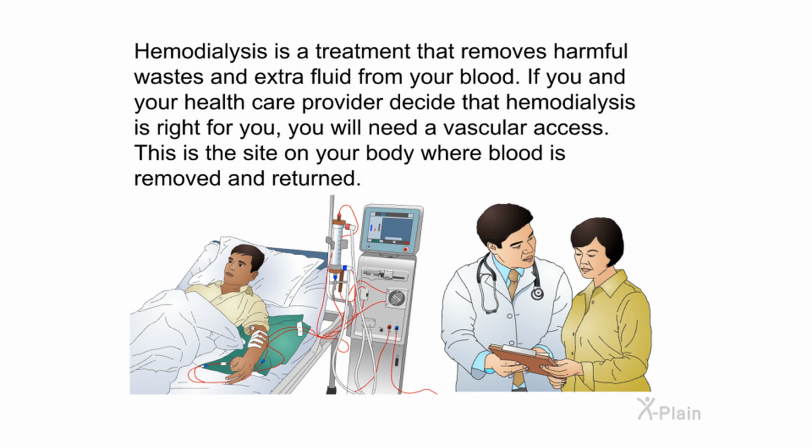Summary. Hemodialysis is a treatment that removes harmful wastes and extra fluid from your blood. If you and your healthcare provider decide that hemodialysis is right for you, you will need a vascular access. This is the site on your body where blood is removed and returned.